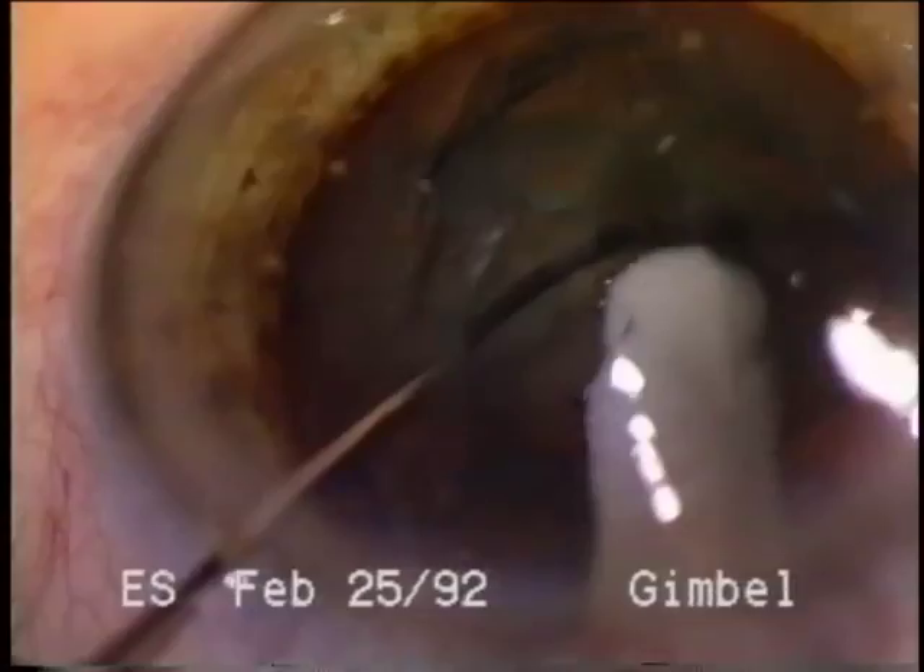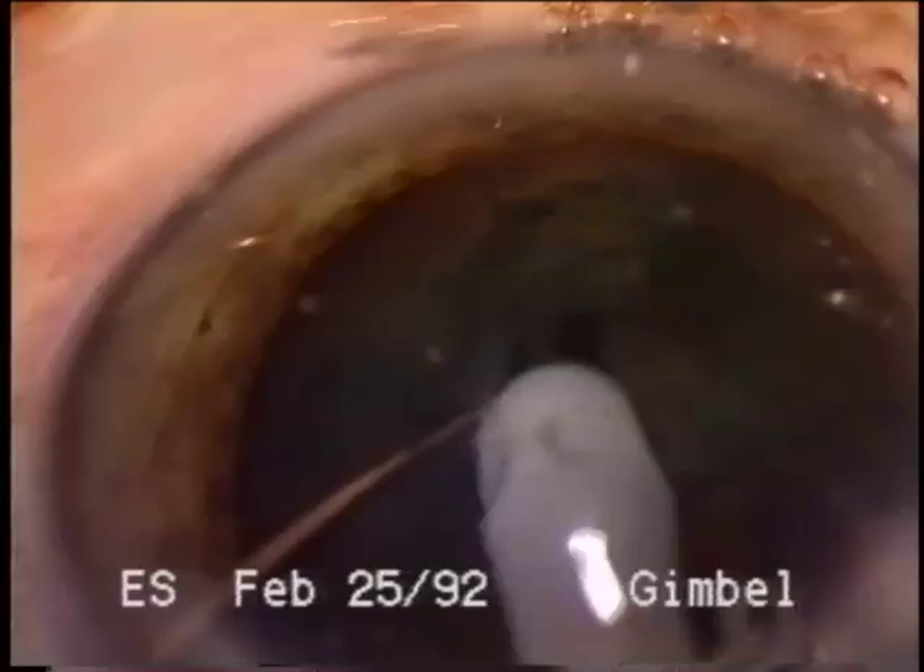Hydrodissection adds safety and efficiency to these cracking techniques, whose inherent principles demand nuclear rotation.